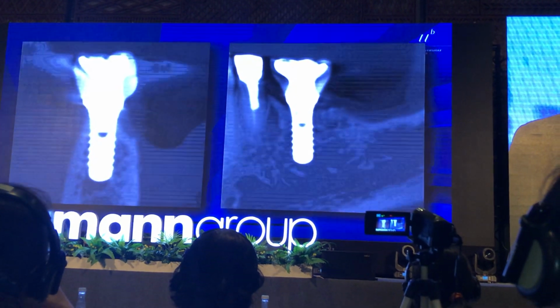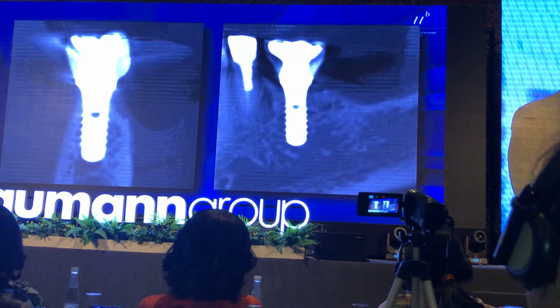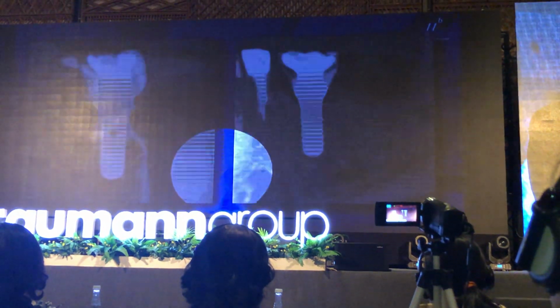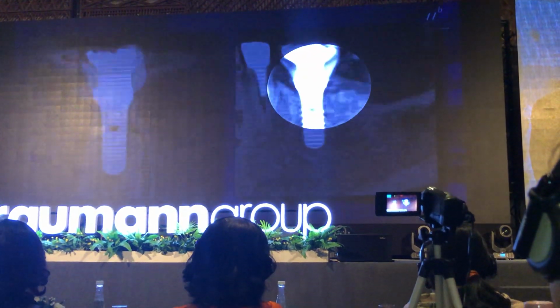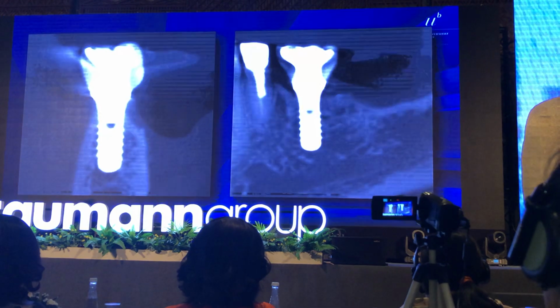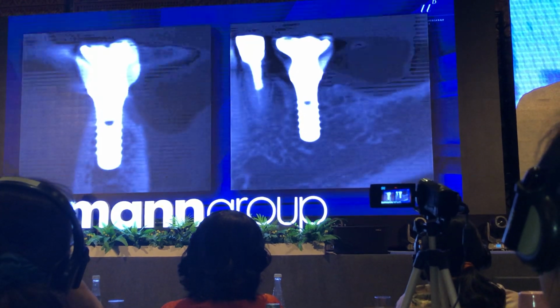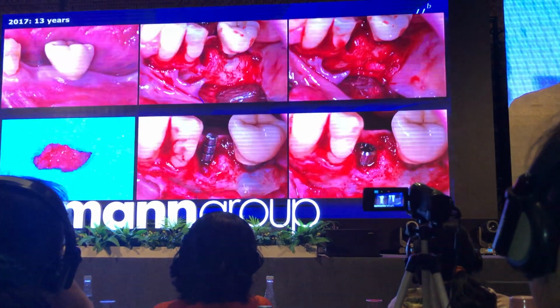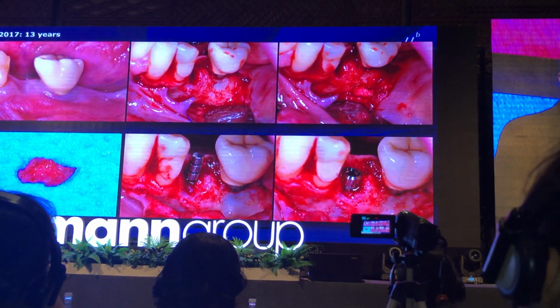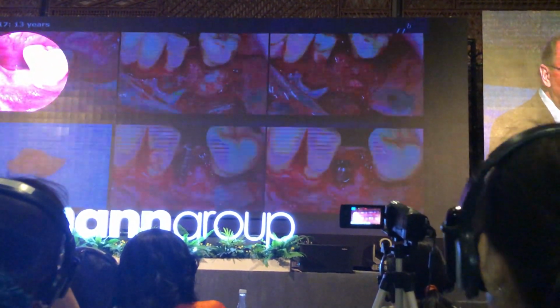Look at this one. This is the implant at 12 years. So the implant has an excellent facial wall and lingual wall, fully embedded in bone. That's how we want to have it. So that was 2016. Guess what happened? She lost the second premolar. I promised you that will not last forever. So then this was removed. That is the 17. Now the patient comes back to me, and the private dentist had extracted number 5.